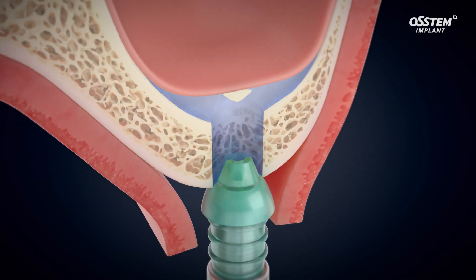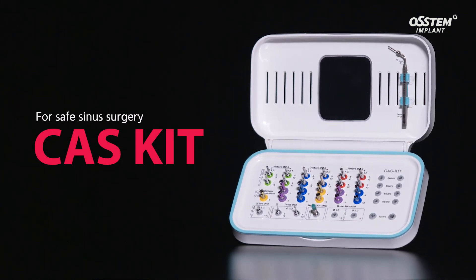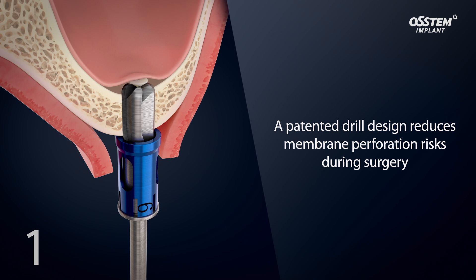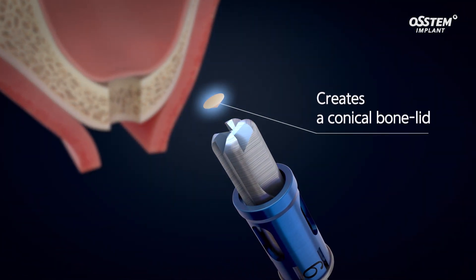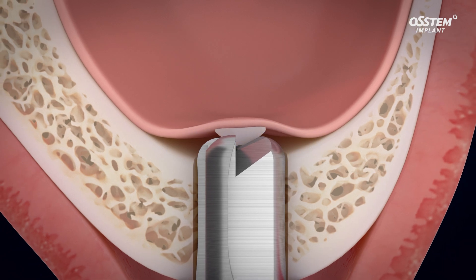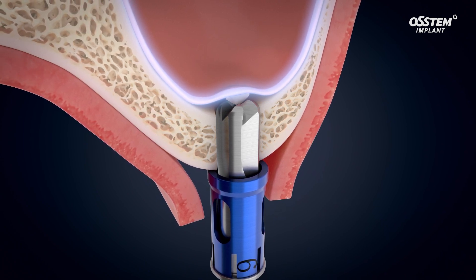Introducing the CAS kit — the Crestal Approach Sinus Kit that safely lifts the sinus membrane with a hydraulic lift system. The CAS kit reduces the chance of membrane perforation. The patented CAS drill creates a conical bone lid that keeps the drill edge from direct contact with the membrane, ensuring safer drilling by preventing sinus membrane perforation.